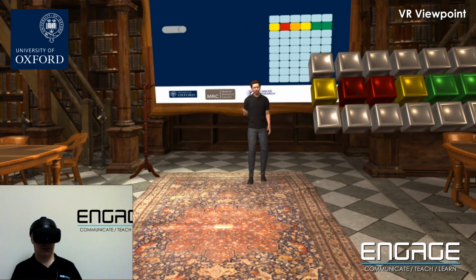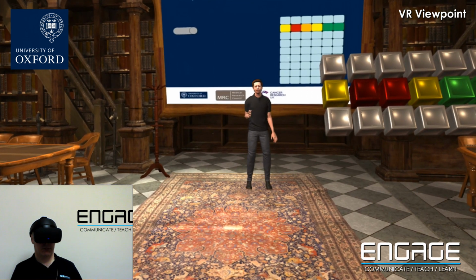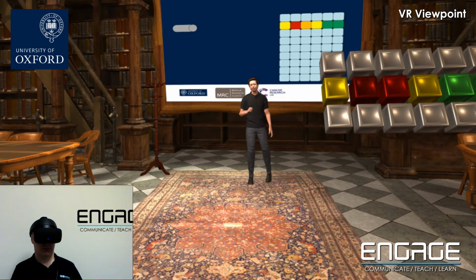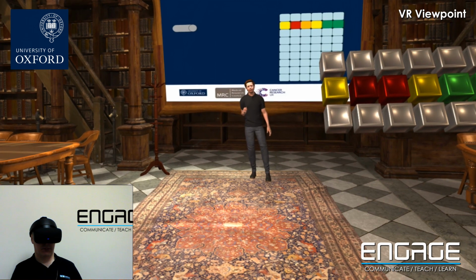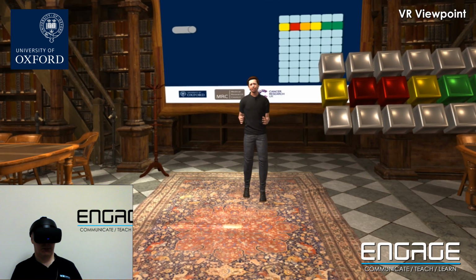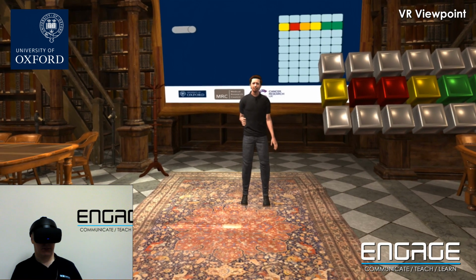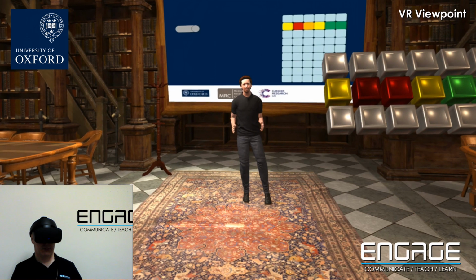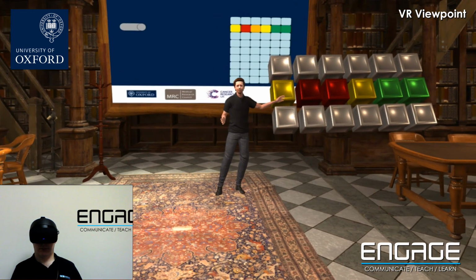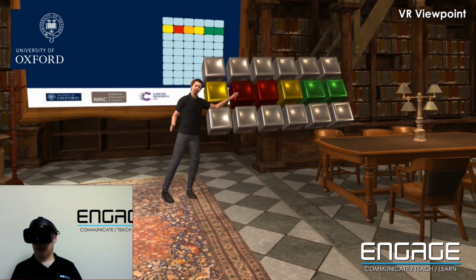If we roll the dice, if we spin the wheel millions and millions of times, if we look at what happens, we find that this is a real simulation of what happens if you throw these little X-ray cannonballs into a human being, into water, in fact. So this is about 0 to 16 centimeters worth of person. And you can see that early on, just inside this bit of water, just inside the patient, I'm getting a little bit of damage which builds up to a maximum at about 1.5 centimeters. So that red block that was being damaged, most of that damage is being left at about 1.5 centimeters. And then the total damage kind of tails off until you're out of the other side of a person.